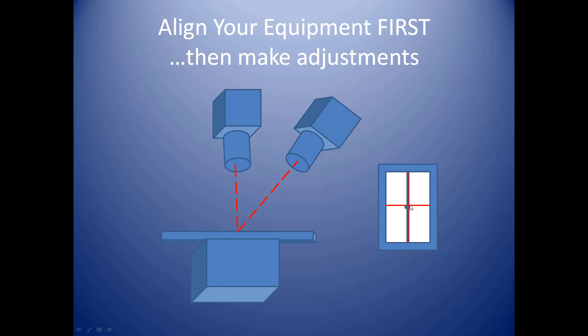There are locks in place — horizontal locks, vertical locks top to bottom, and longitudinal locks. As you depress your controls on your tube, it will lock you in place longitudinally, width-wise, and height-wise, so you'll know that you're locked in place to your cassette.